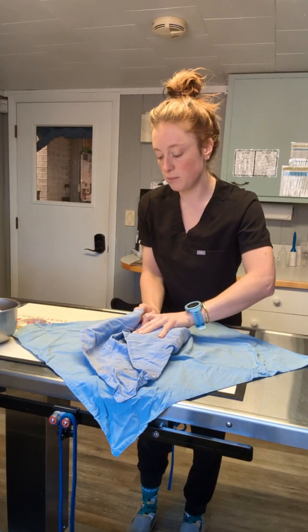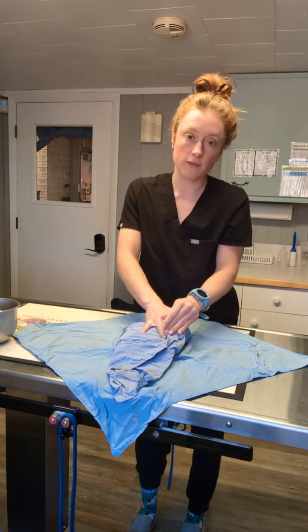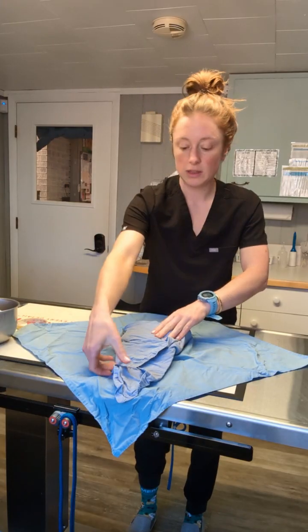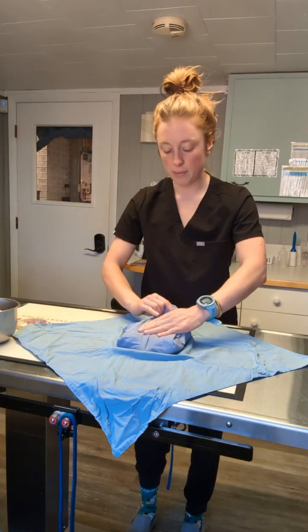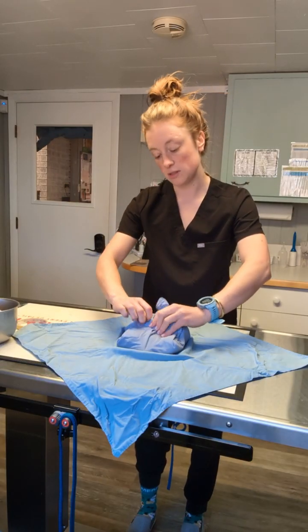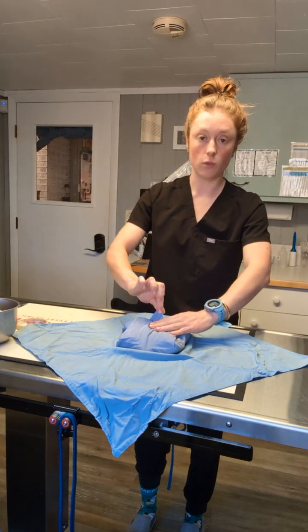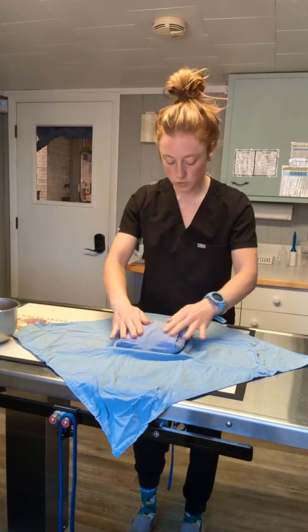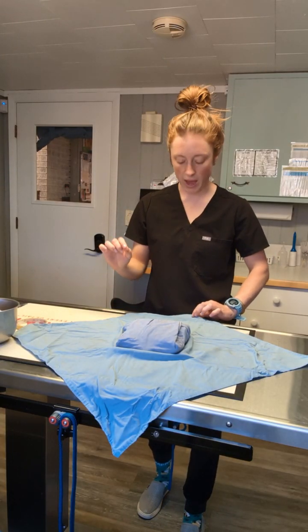And the right side, making sure all this is nice and taut. And again, folding back one corner. And lastly, the furthest side, wrapping that in, and then I'm going to tuck this underneath. And again, leaving one corner sticking out so that can be pulled without touching all the contents of the pack.